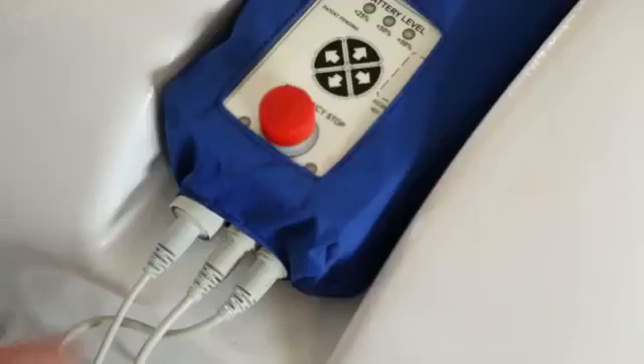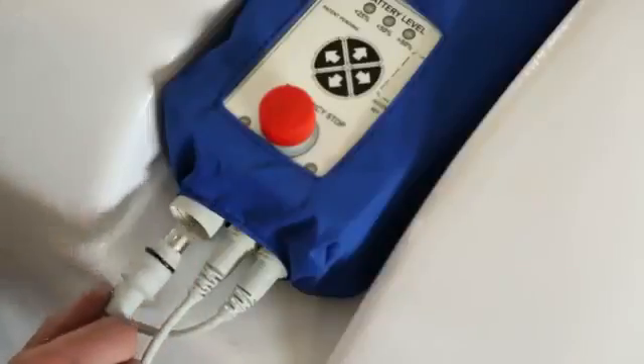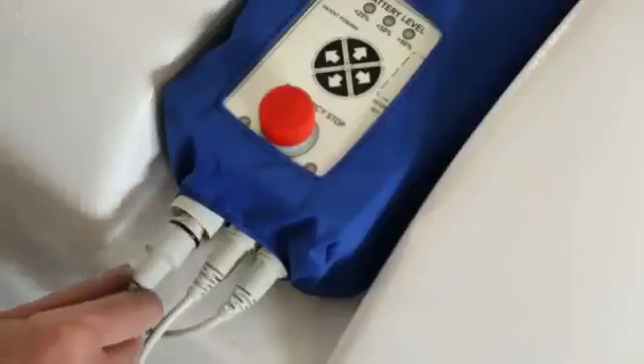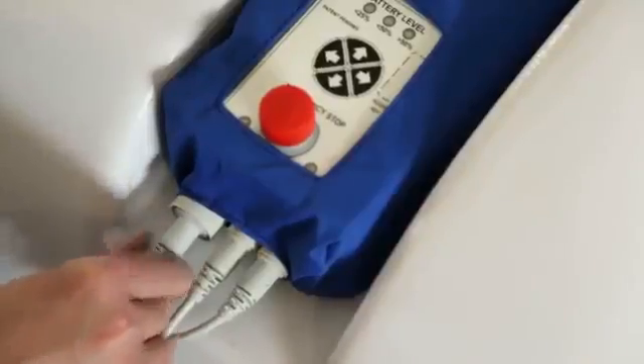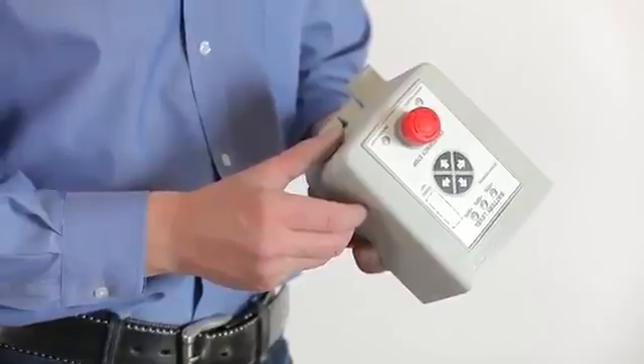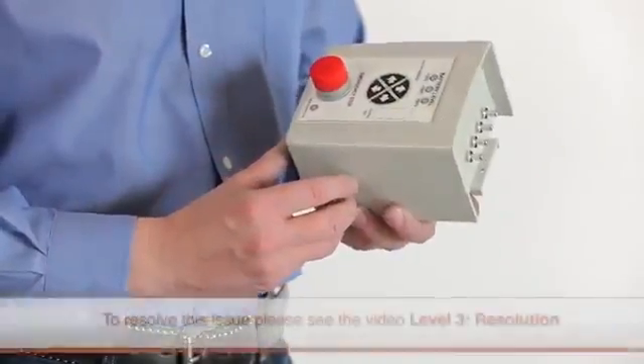To replace the hand control, simply unplug the old hand control from the control box and replace it with a new unit. Make sure the new control is securely connected to the control box. At this point, if the lift still does not operate, the control box is not operational and may need to be replaced.